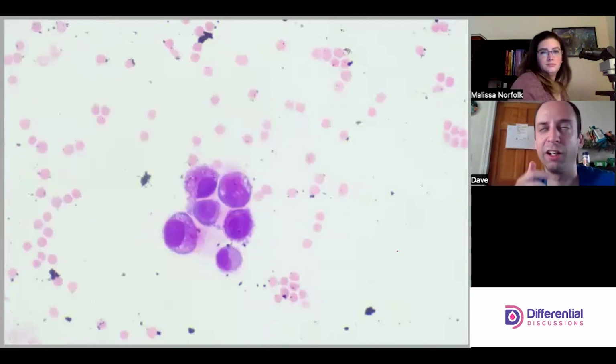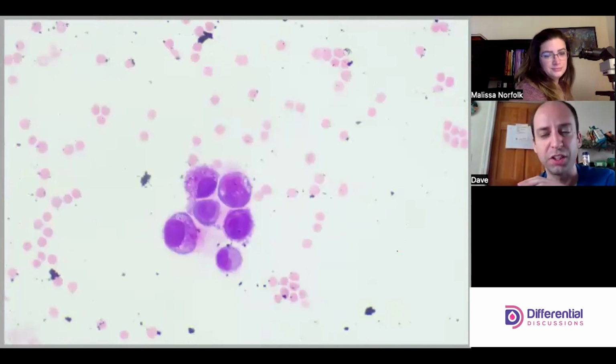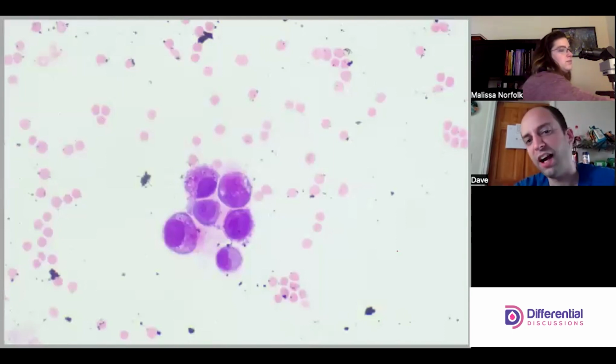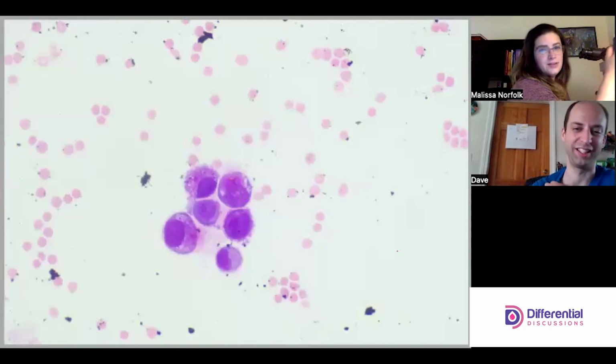Red cells are around 8 microns, and when you smush them the diameter is a little bigger. These cells are quite large, and there's a sameness. There's an oogliness, and we need to see what the heck is going on here.